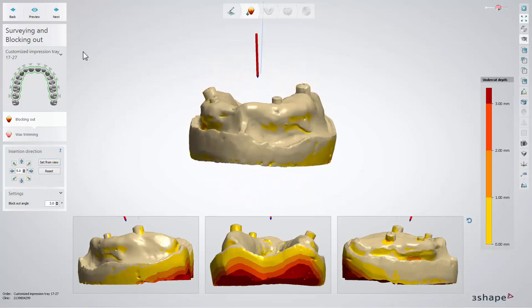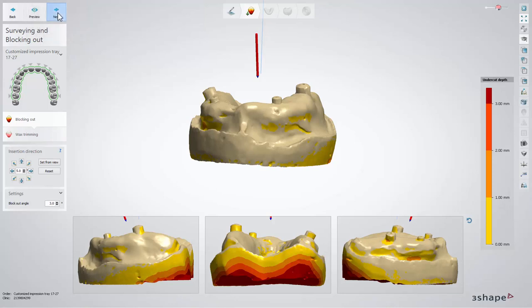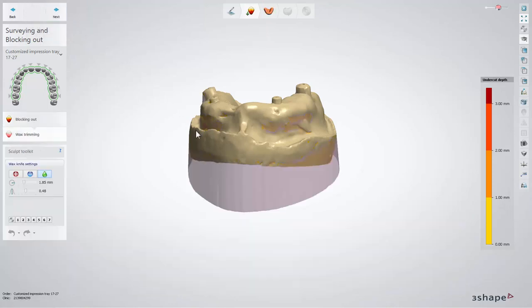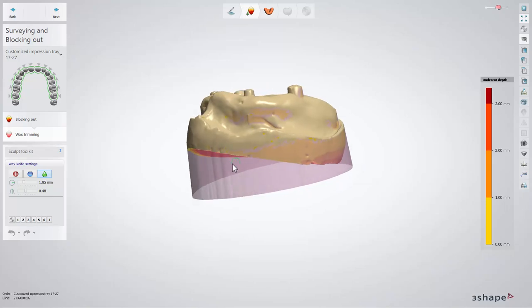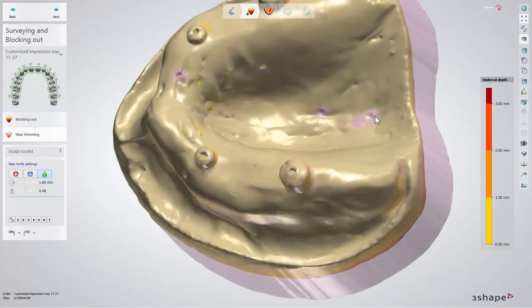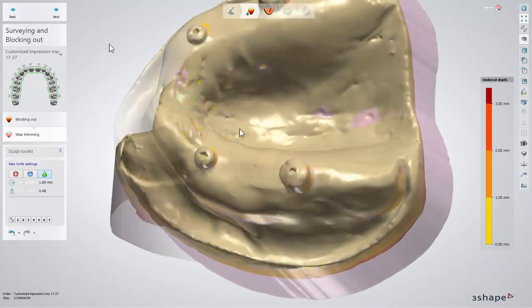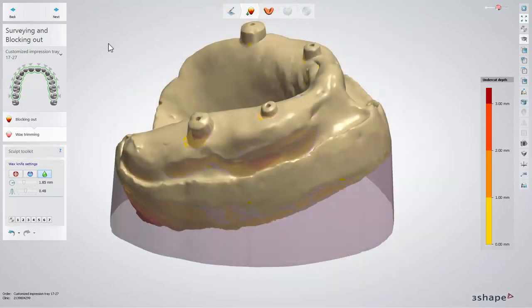Move to the wax trimming step by clicking Next. Here you can trim or add additional wax if it is necessary. When you are ready click Next.